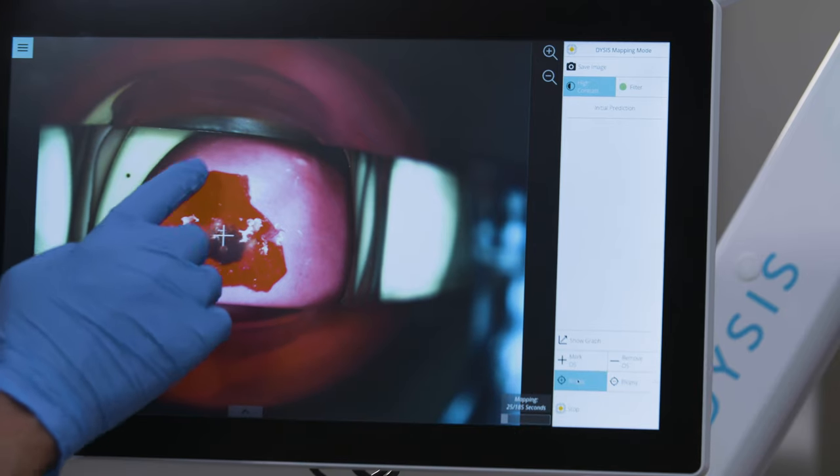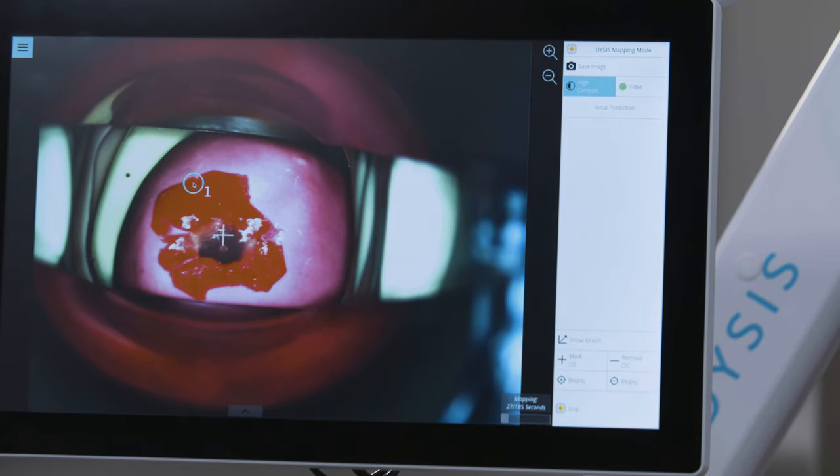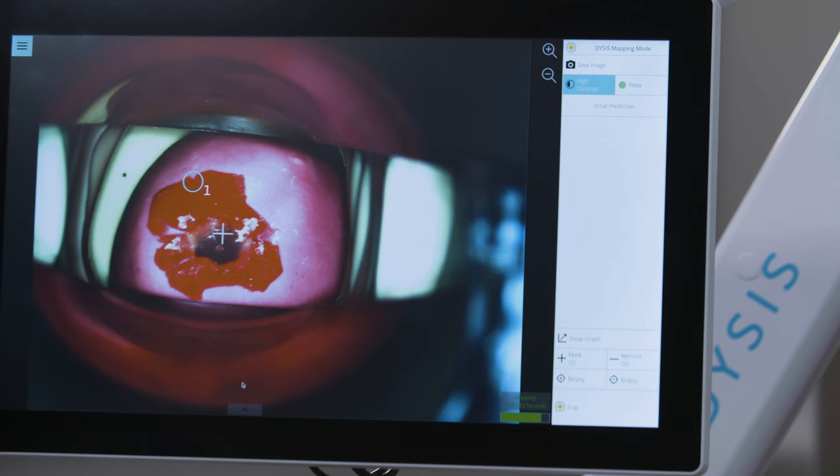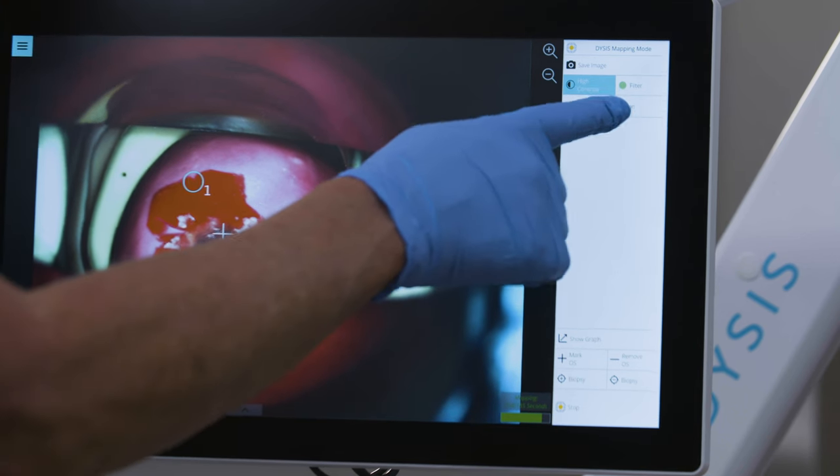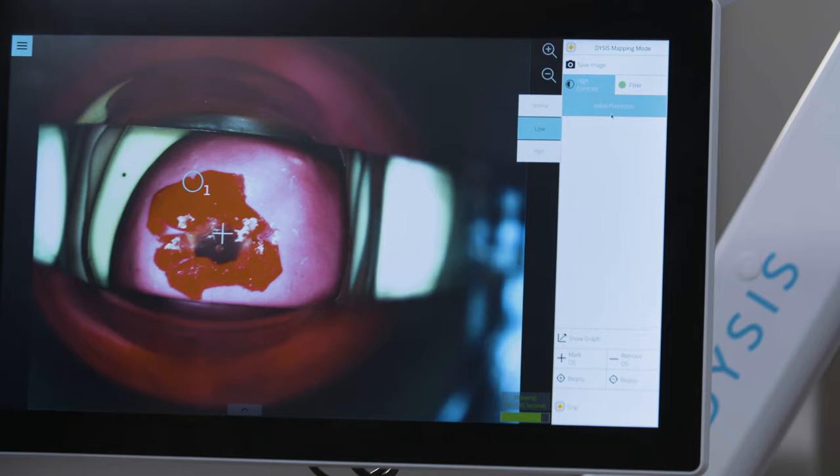Digital biopsy markers can be placed on the cervix at any time during the examination. After you have completed your visual assessment, initial prediction, and biopsy site selection, the Dysys map may then be displayed.